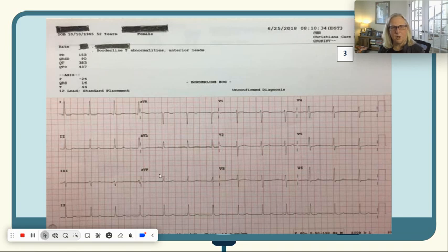And this is pretty small, but is it the smallest one of all of them? Because look over here, this is pretty small too. It's negative, but it's still pretty small. We're just looking at the size. It doesn't matter if it's positive or negative. We're just looking at the size, okay? They're kind of about the same size. But if you called it 0, that's fine, because this would be the smallest, this is the tallest, and we'll go with 0.